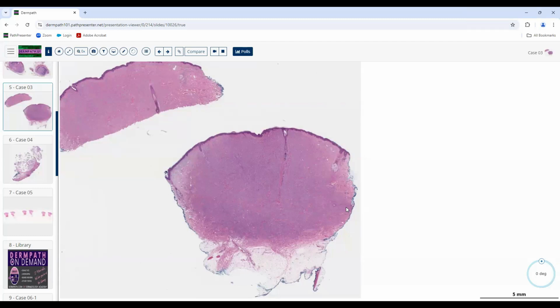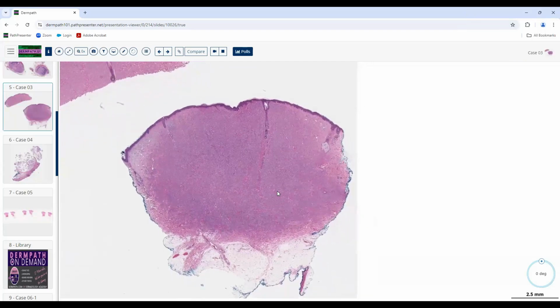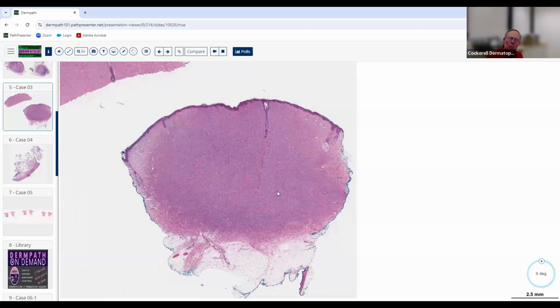Agree. Now, do you think this is going to be epithelial or non-epithelial? This one might get a little tricky at low mag. Because from this power, perhaps you would think epithelioid. But is it one of the traditional types of epithelium that we see? Like the last, we said follicular, we can see that pretty obviously at low power. What about here? I can't discern a distinct pattern.